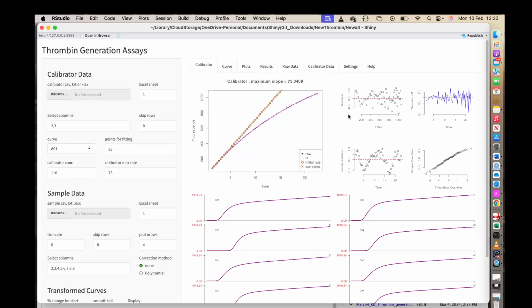In the top right corner, the red line for thrombin concentration should pass centrally through the blue curve. It is expected that the blue line becomes more erratic over time as correction becomes more difficult. Also, in practical terms, you should try to minimize artifacts due to mixing or temperature changes at the beginning of calibrator curve time courses. These can also upset curve fitting. The parameters that are derived from the fitting will be used to correct your raw data.